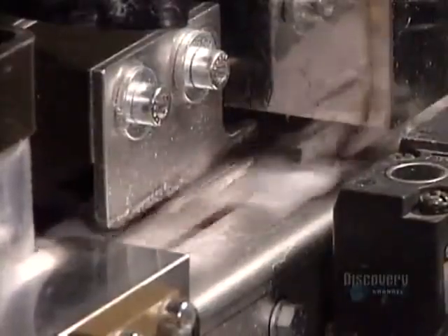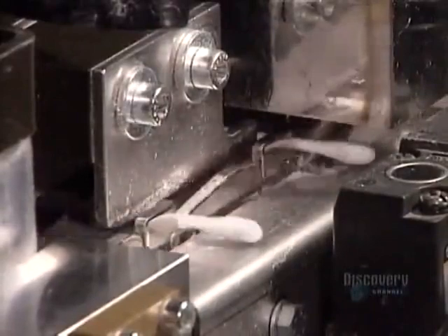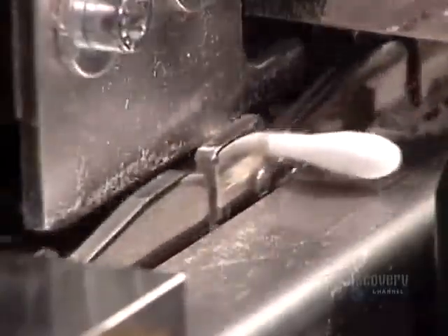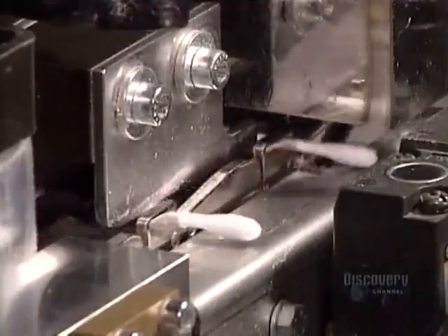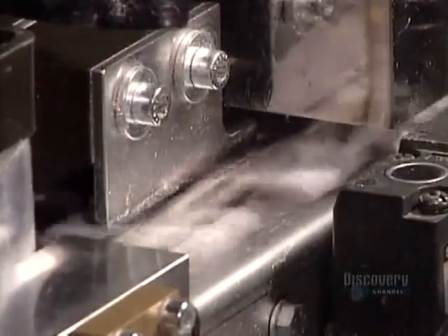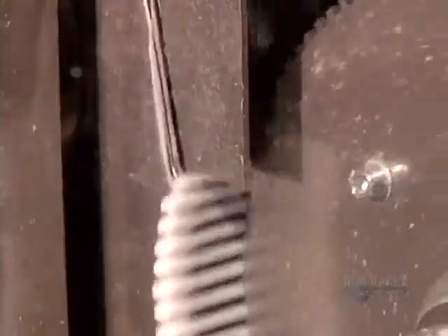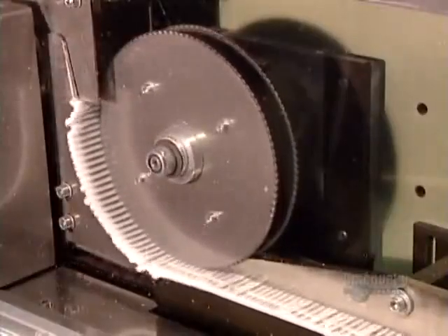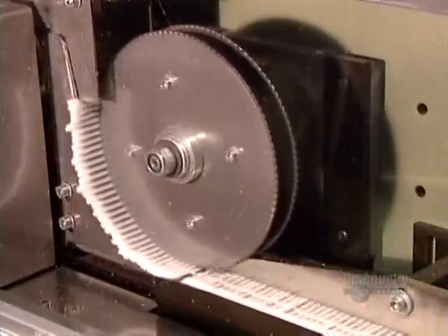The finished swabs are sprayed with an antibacterial solution — here's that action in slow motion, and now in real time: 2,000 swabs per minute. Sensors detect any defective swabs and automatically toss them off the production line. If you look closely, every so often you'll see one missing.